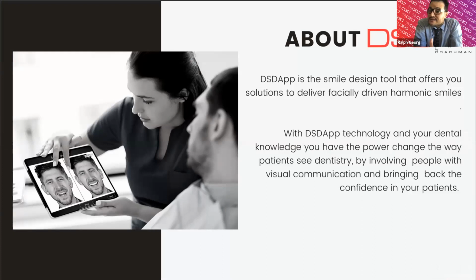It's a smile design tool that offers you solutions to deliver facially driven harmonic smiles, very important, harmonic smiles. With our DSDAPP technology and your dental knowledge, you have the power to change the way patients see dentistry by involving people with visual communication and bringing back the confidence in your patient. This is a great tool that also helps you increase your treatment acceptance.